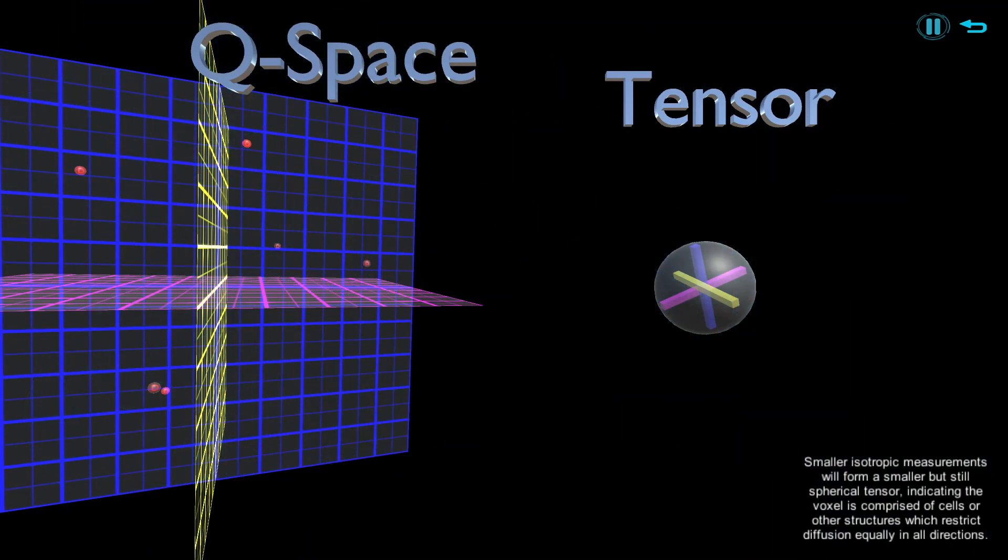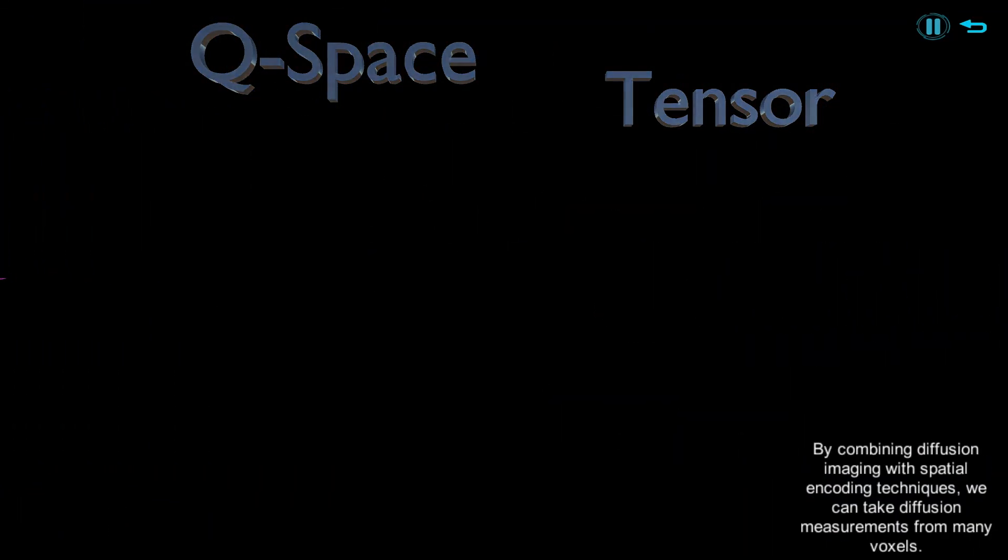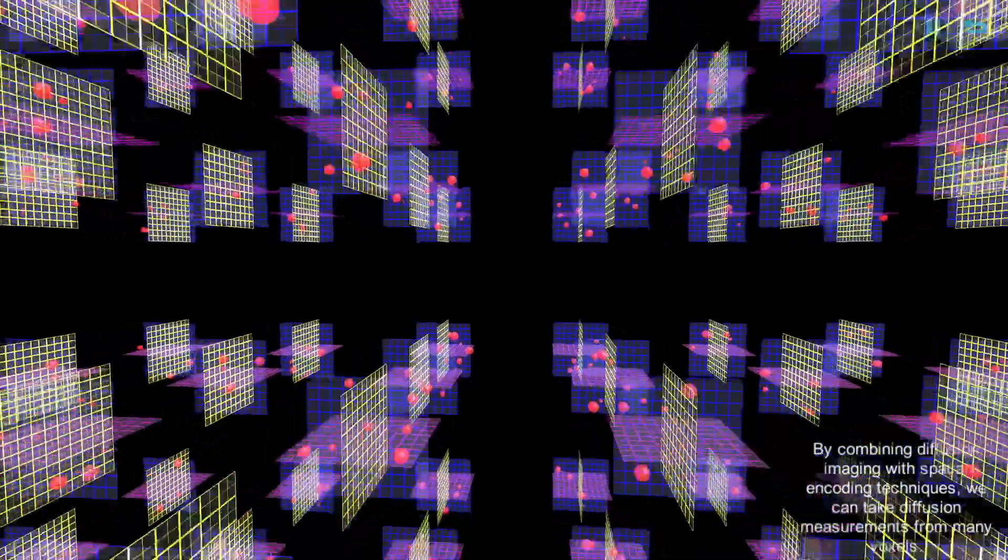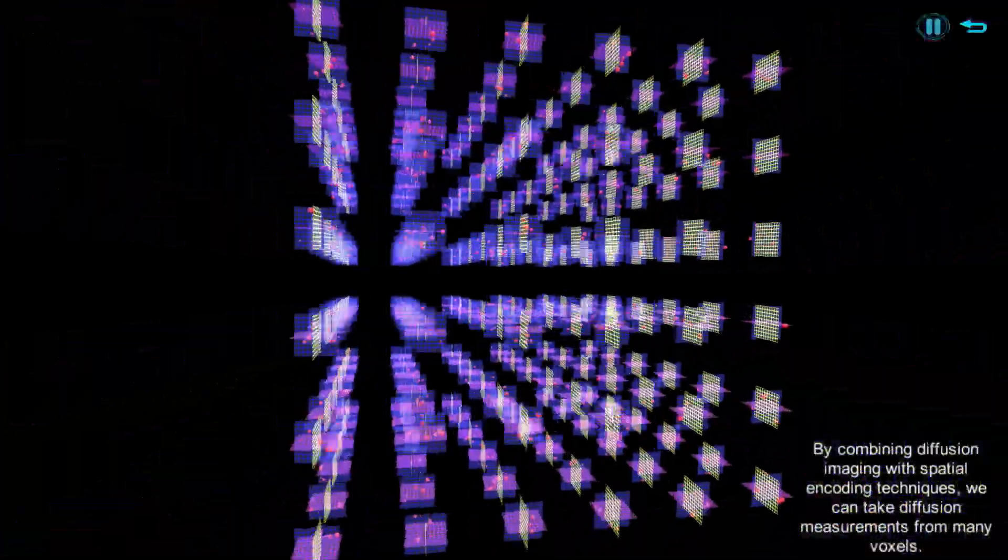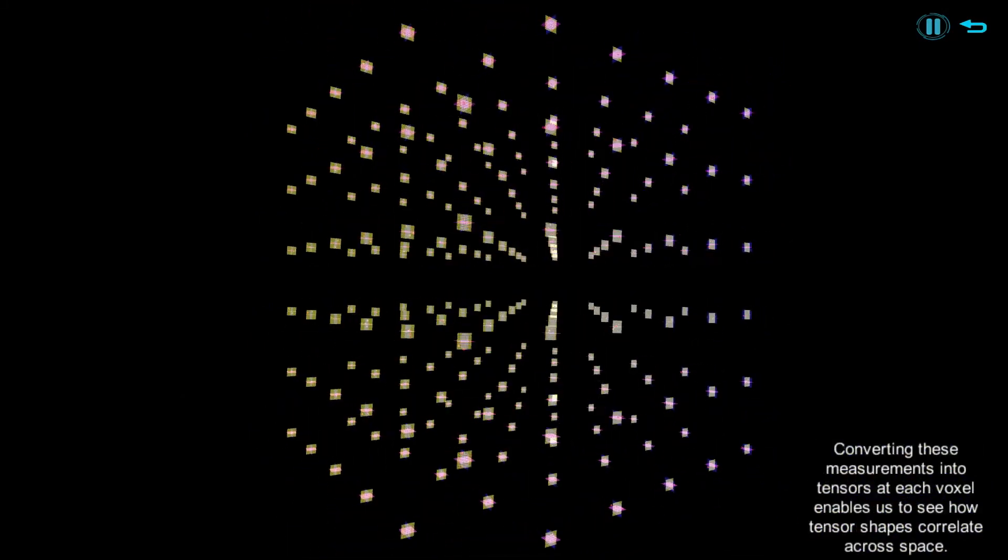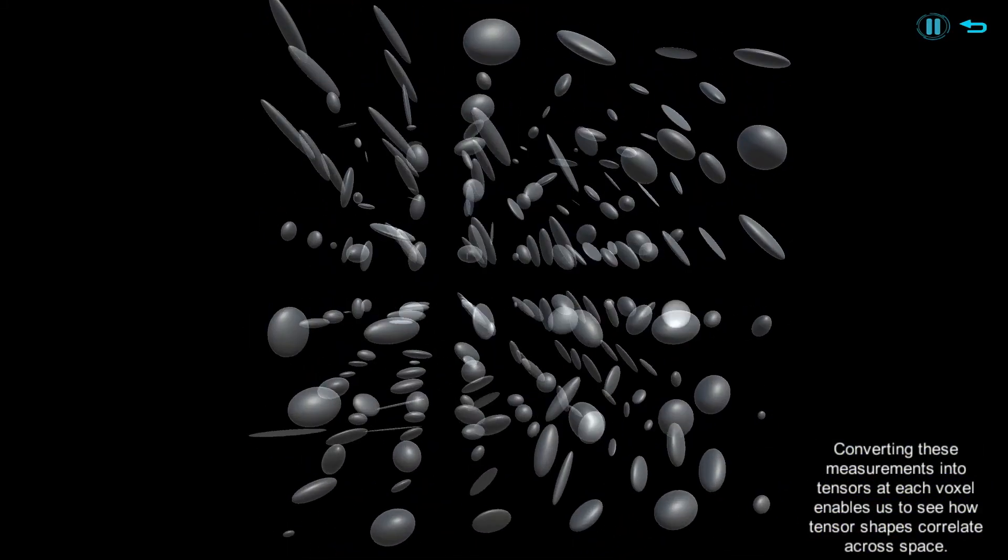By combining diffusion imaging with spatial encoding techniques, we can take diffusion measurements from many voxels. Converting these measurements into tensors at each voxel enables us to see how tensor shapes correlate across space.